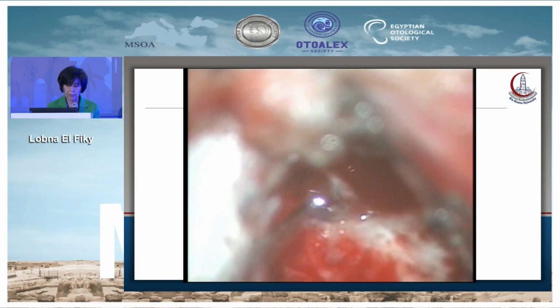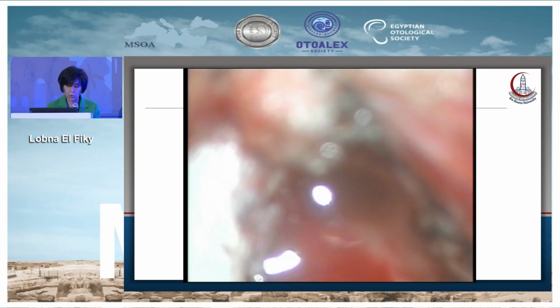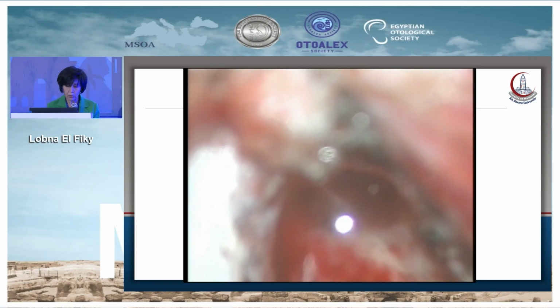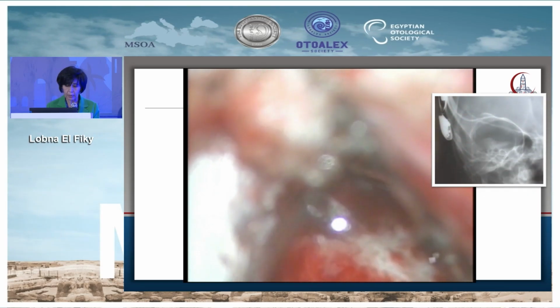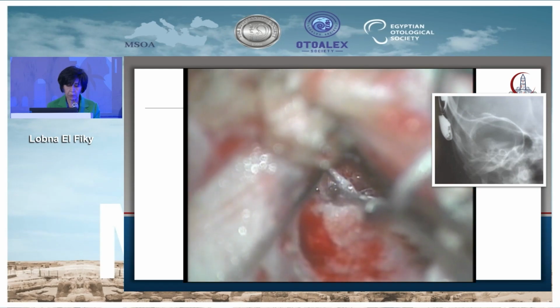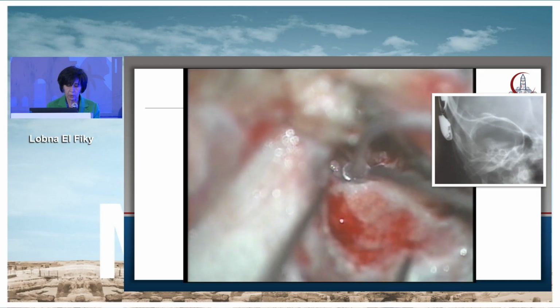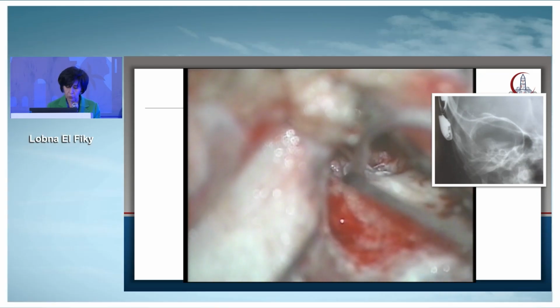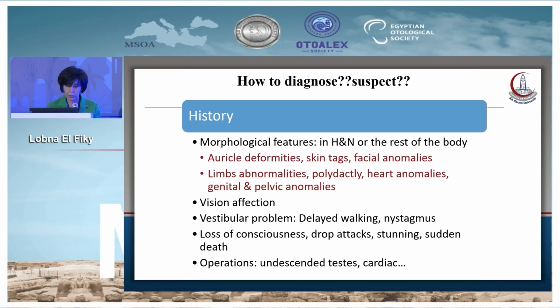So you can see the thick chorda tympani in an abnormal position. And of course, an oozer more or less, or a slight gusher with the IP2. However, they can accommodate any type of electrode, but we don't prefer the perimodiolar. We prefer the lateral wall, and here for the control of the perilymph gusher, we also use the form electrode with the stopper for it.